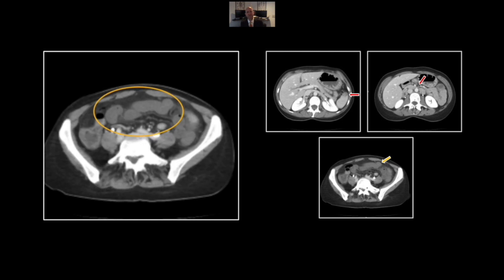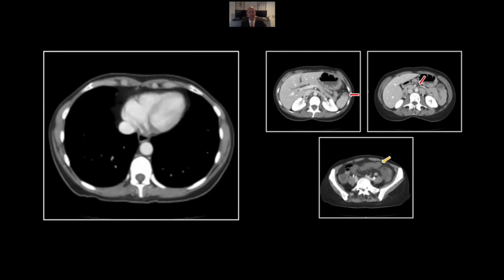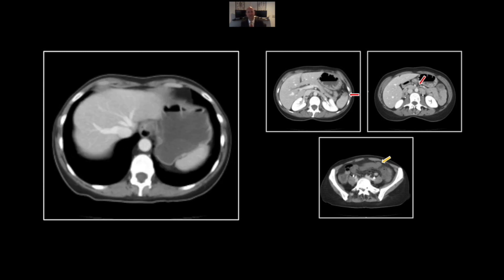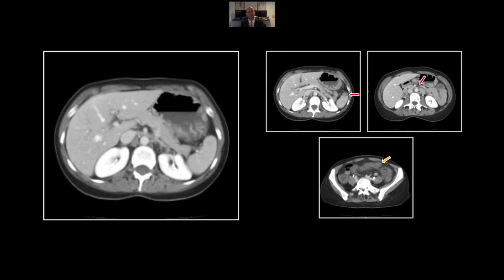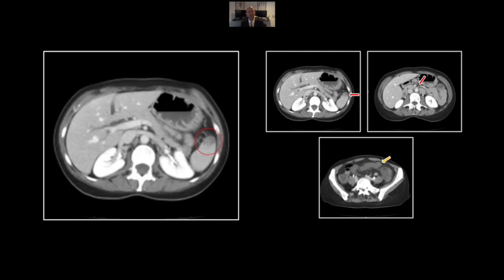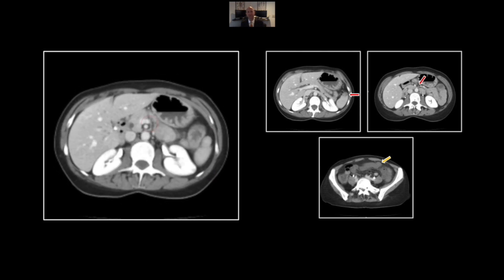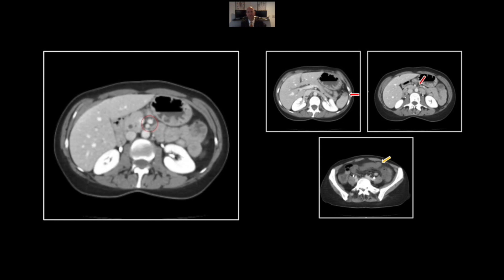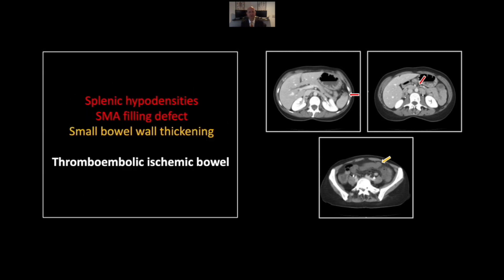This is a patient who had a cardiac source of emboli. On delayed images, the splenic hypodensities had resolved — do not let that dissuade you from the accurate diagnosis of a thromboembolic ischemic bowel.